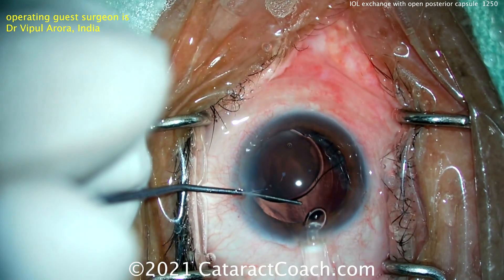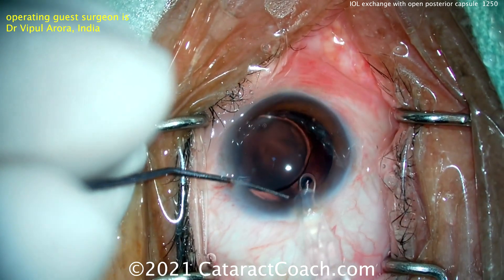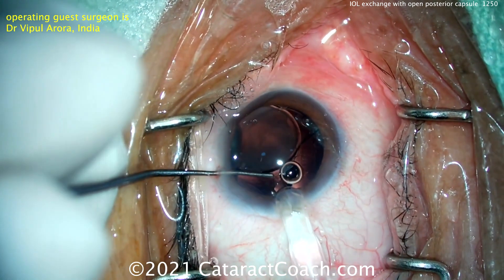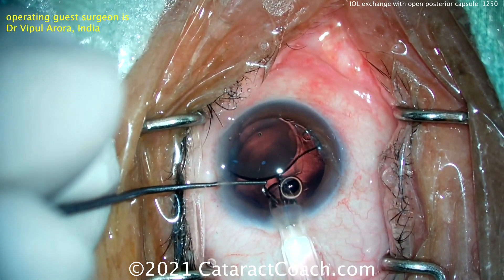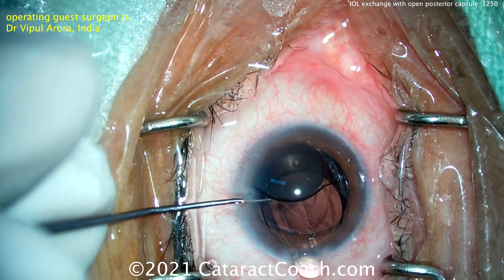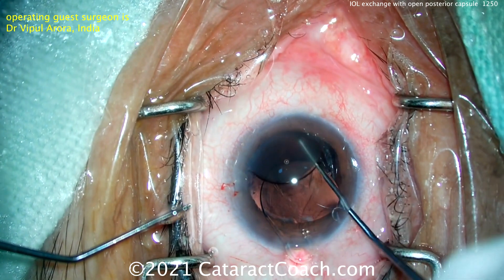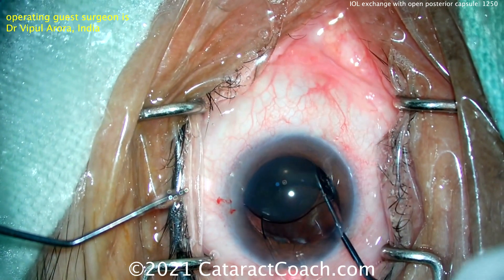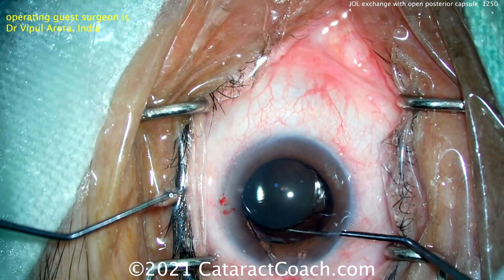Now lifting up the lens to create a gap — and what are you going to put in that gap? The new lens. Inserting the new IOL underneath the existing lens first, so for a moment you're going to have two IOLs in the eye at the same time. Getting that lens in nice and gently. Get the new lens into position first, make sure it goes in the capsular bag where you want it. Then get it gently rotated in.